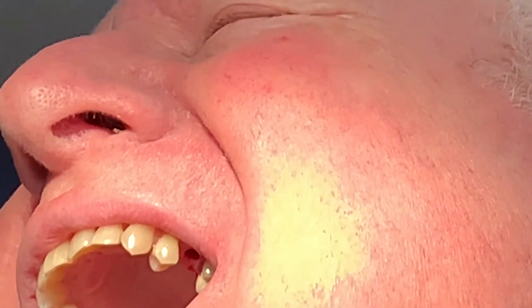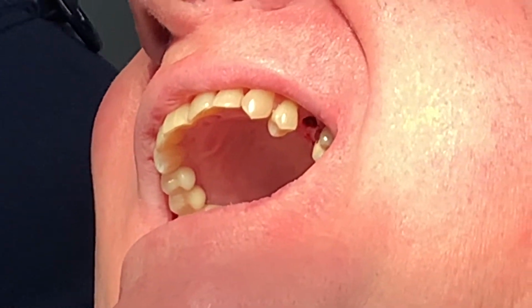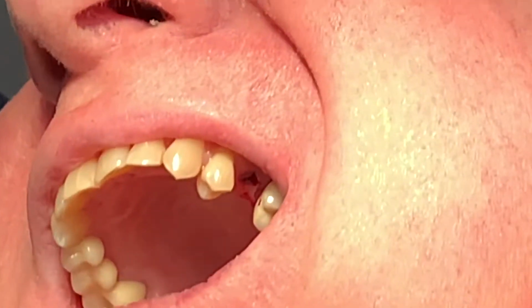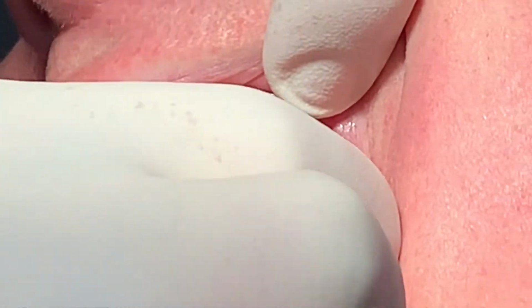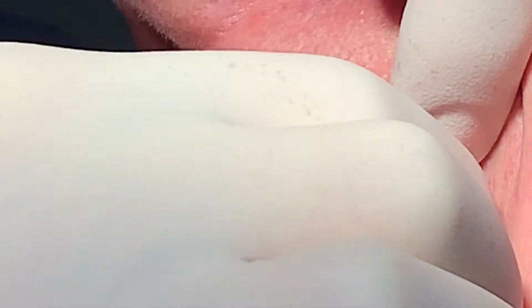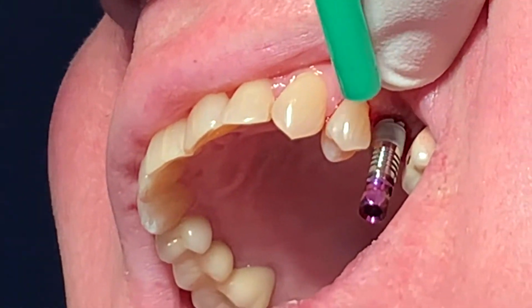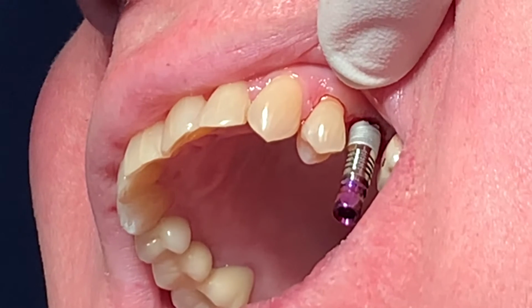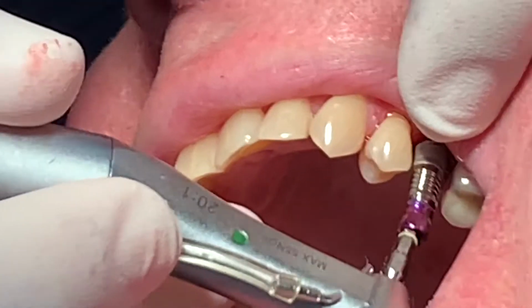Start the threading with your hands. With my hands? Yes. So you can feel the threading. All right. Per Dr. Nisnik's request, I am starting the threads with my hands. Now I'm a wimpy LA guy, so I think I can twist this to about 3 Newton centimeters. Okay, I started the threads. It feels pretty dense, so I might have to go 1 drill size higher, but let's just go ahead and see.